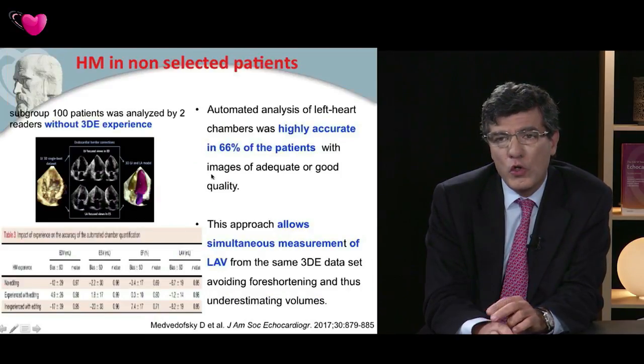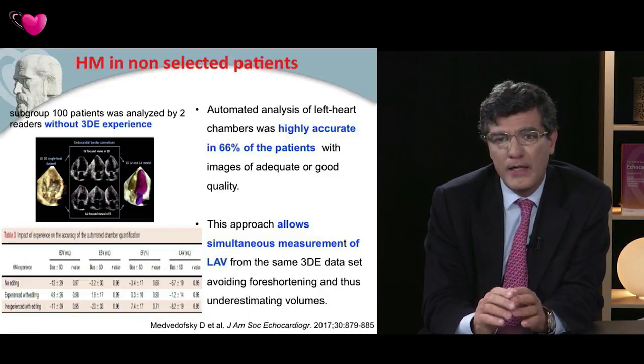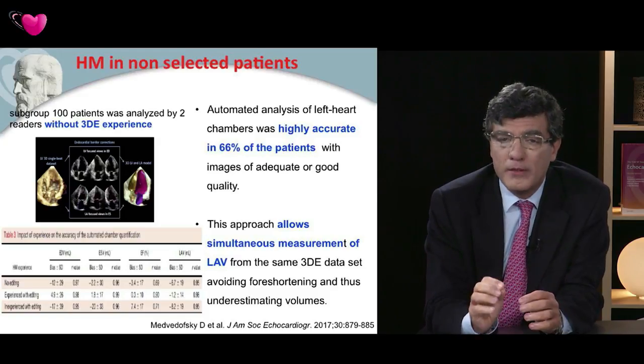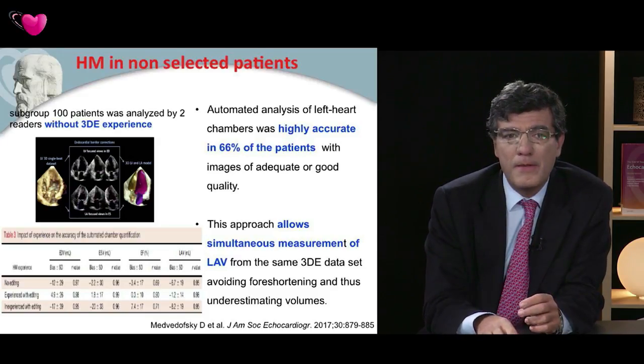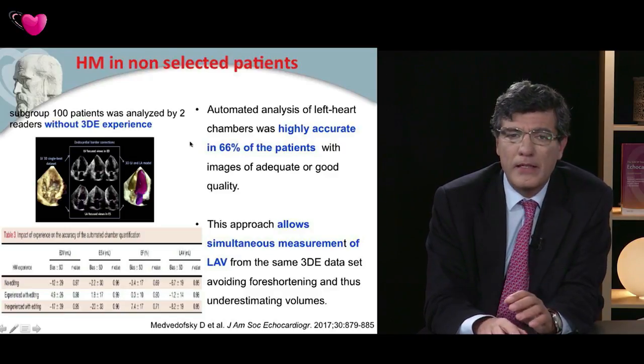So the next question will be, do we need an experienced echocardiographer, cardiologists, or technicians to obtain those data? Well, this is again the analysis of 100 patients that were analyzed without any 3D echo experience. So what happened in these cases?